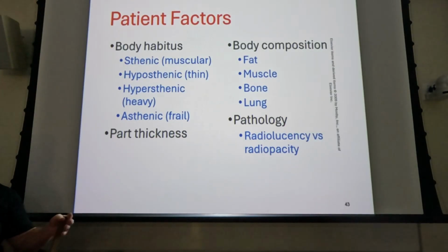Less dense, specifically anything that's kind of like water, right? Well, what's a pleural effusion? Water.